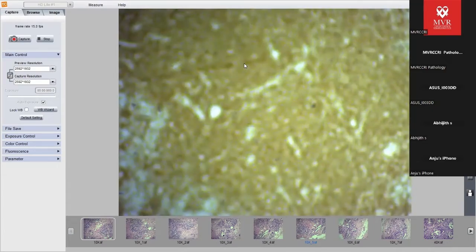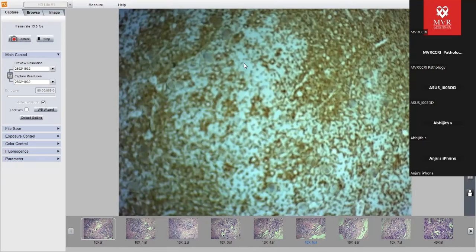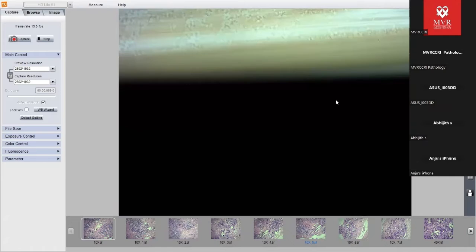We discussed with the clinician. Clinician was like, this is the T cells. I mean, CD3. You see the beautiful rosetting of the CD3 around these large cells? We didn't have PD1. NLPHL classically shows CD3, PD1 positive T cells rosetting around the large cells. But then there's this rosetting of T cells. This is CD3. The background, if you see, is T cell rich.